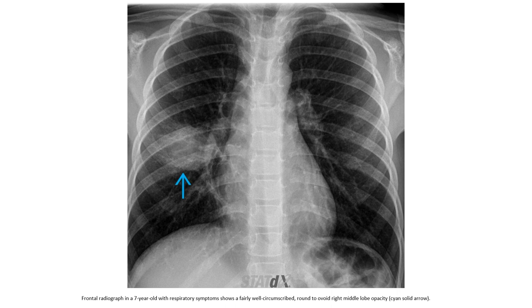Frontal radiograph in a seven-year-old with respiratory symptoms, showing a fairly well-defined, circumscribed round to oval right middle lobe opacity.